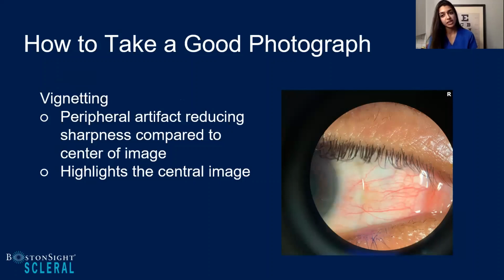But this can oftentimes work to a disadvantage in the real world of scleral lenses. So this is a perfect image of a scleral lens that's causing impingement on a pinguecula. And I held up my iPhone to my slit lamp ocular and tried to take the image. But a lot of the periphery of that image is artifact caused by the actual ocular. And so while I do have this beautiful area of blanching and impingement over this pinguecula, I'm kind of losing it because of how much wasted space I have due to that ocular.